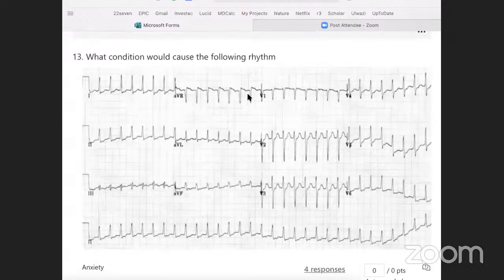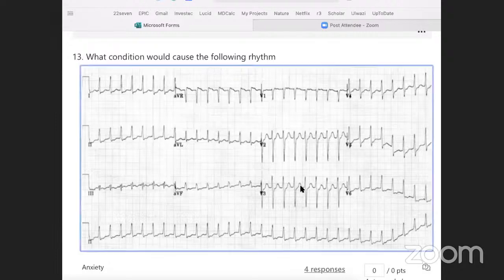Alrighty. So this is a sinus tachycardia, also quite difficult to discern, but we can see P waves preceding each QRS complex, regular, narrow. All of our intervals seem to be quite regular, and diffusely throughout our ECG, there's ST segment depression. So we know that when we do stress ECGs on patients, we expect different values in terms of ST segment depression within that ECG.